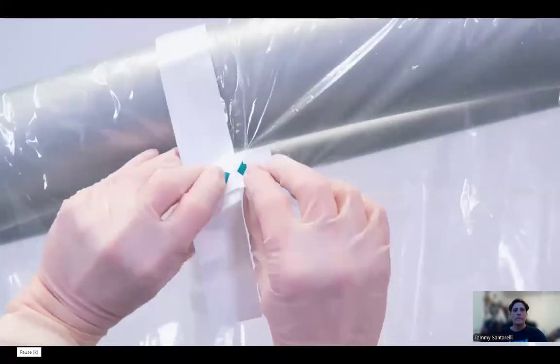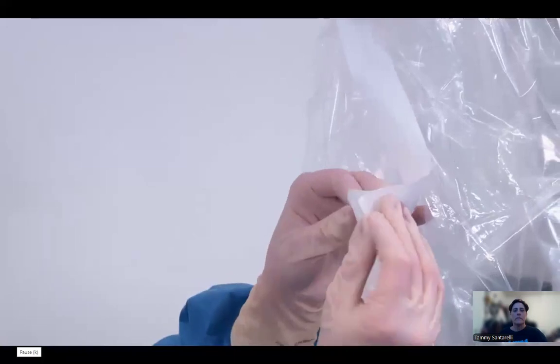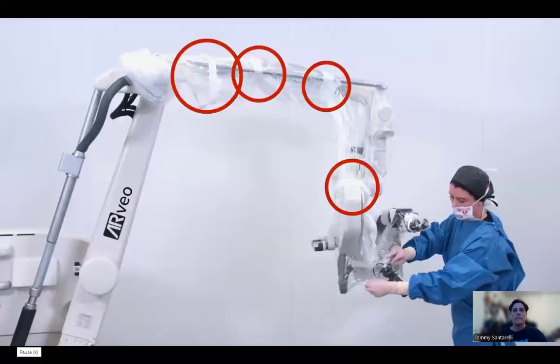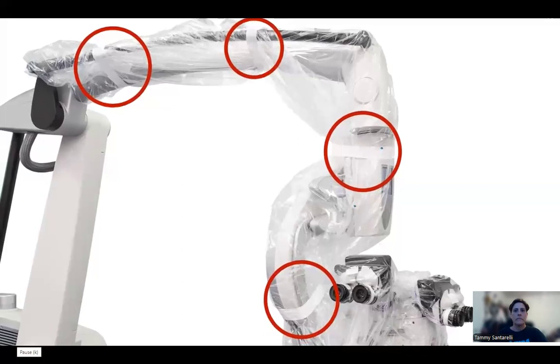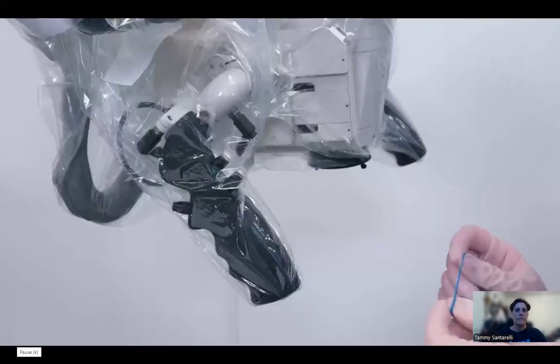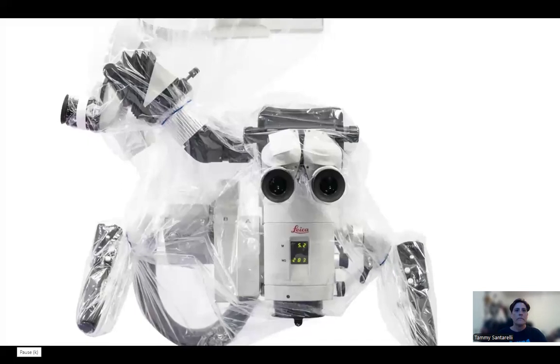Wrap the bands around the microscope head and arm, placing them taped to tape and not taped to plastic, and making sure the drape is fitted airtight to the microscope. Check that the straps are attached around the microscope head and around the arm as shown in the images. Choose the option that best suits your surgical practice. If necessary, the rubber bands can be used to keep the drape tighter to the handles and the main surgeon and assistant binocular tubes.